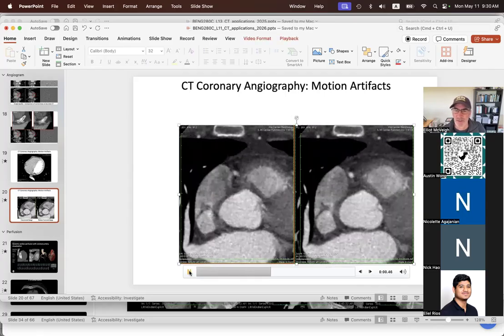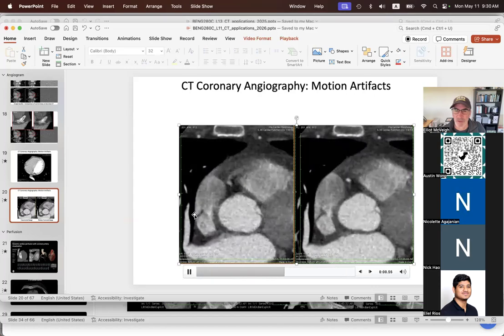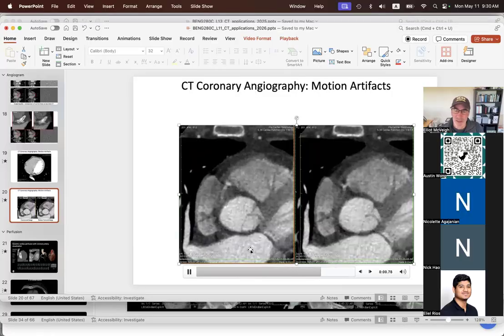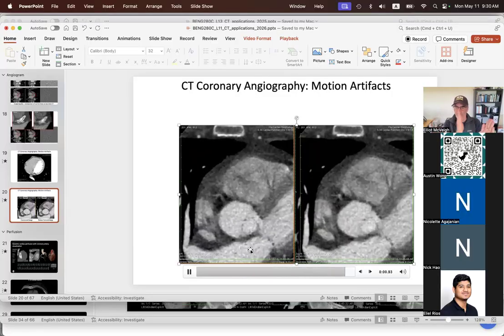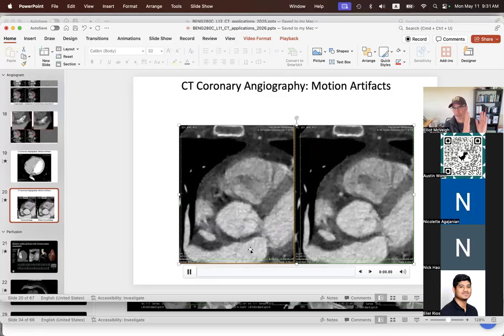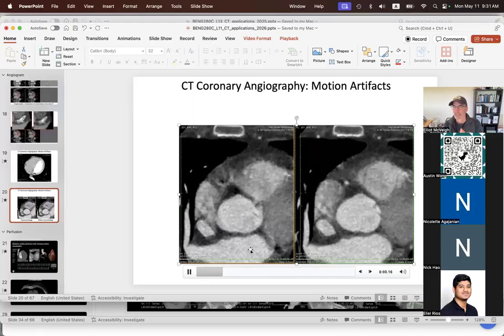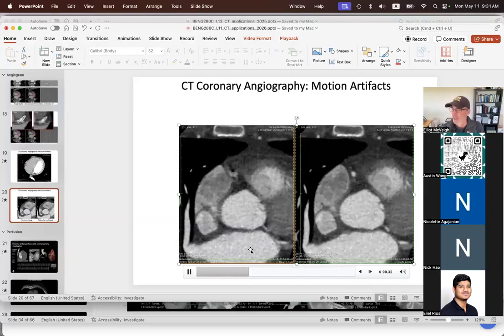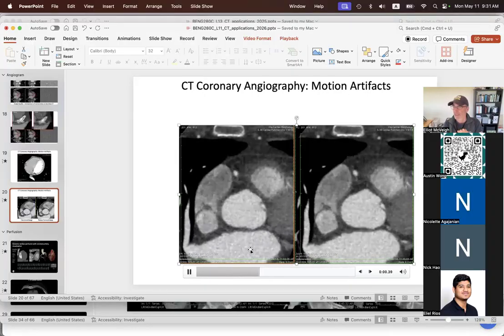And so if we look at this movie of a set of, say, 10 images taken over the course of the heart cycle, we essentially make a movie every 100 milliseconds. And that movie usually requires 150 milliseconds of data around that time point.